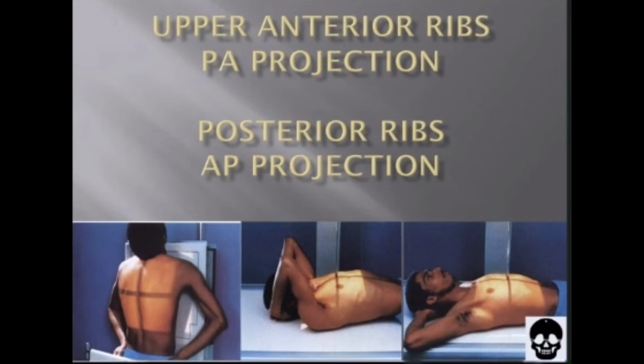In radiography of the ribs, the patient is usually examined with respiration suspended in either full inspiration or expiration. Occasionally, shallow breathing may be used to obliterate lung markings. If this technique is used, breathing must be shallow enough to ensure that the ribs are not elevated or depressed, as described in the anatomy portion of this chapter.